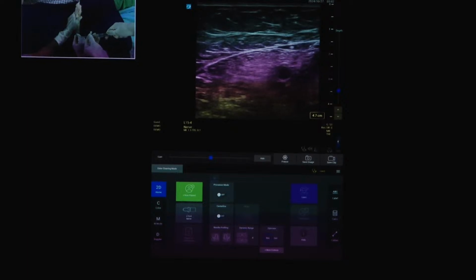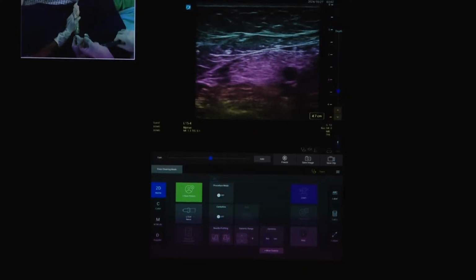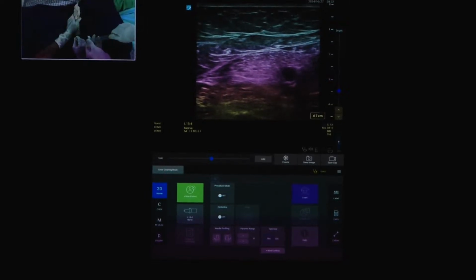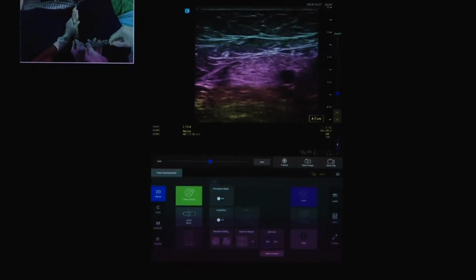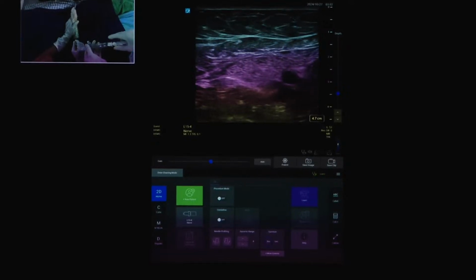Dr. Sai has given first normal saline to check the position. Once it is in position, just move a little up, because we want displacement of the vessels also. It is very close to the vessels actually. He is aspirating many times before giving the drug. I am giving 0.25% Sensorcaine. One minute, I just want to come out a little. Yes, try.